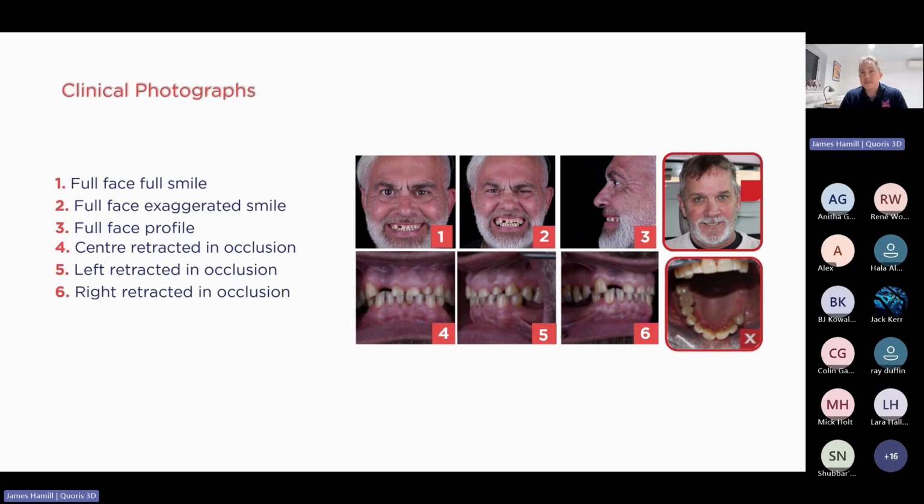This is a skill that we've taken through from guided smile and using an analog process called the rapid appliance transfer. And we've become very, very good at doing that in 2 appointments. And this has allowed us to carry this skill across into DigiBridge, which is still allowing us to do it largely within 2 appointments for the vast majority of cases. But we have to have really good records.